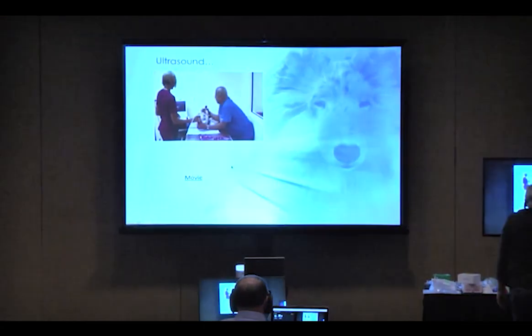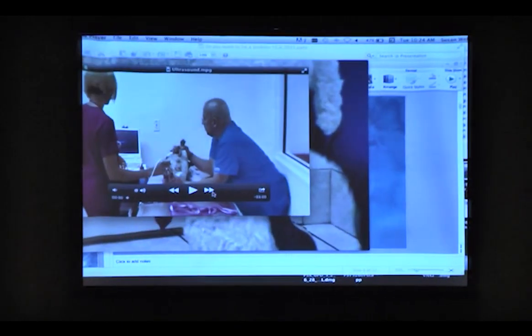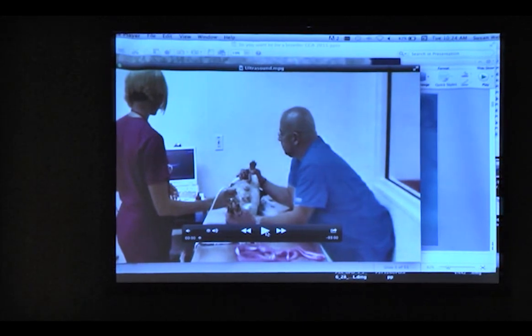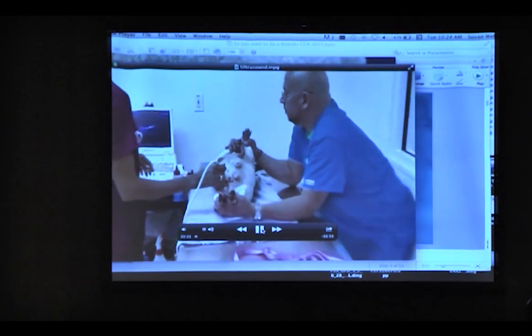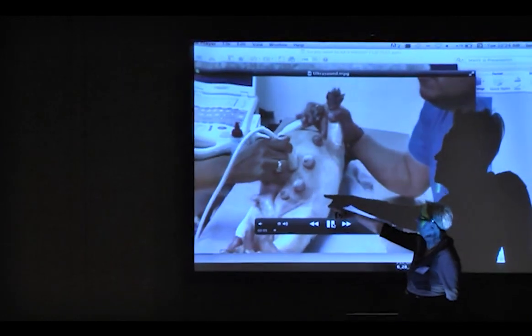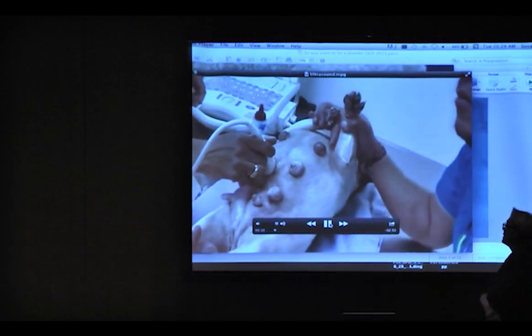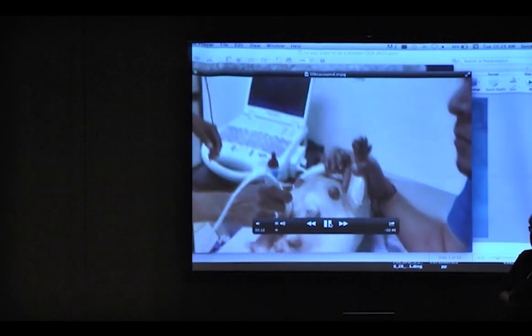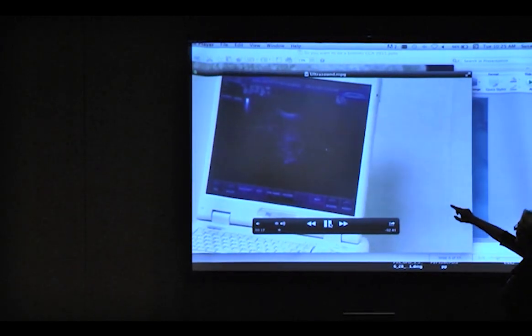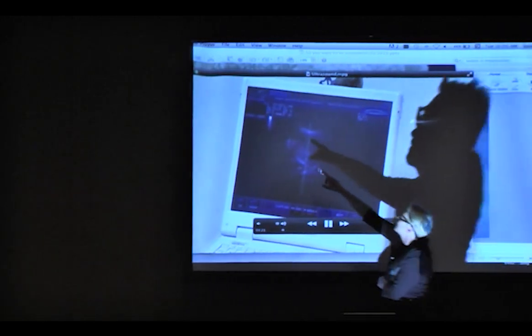All righty, here is a little ultrasound of a movie. This is obviously a bitch that has been bred many, many times, as you can tell by the giant nipples. But it's a Frenchie bulldog, you know? And if you can hear the sound on here, you will see a heart in there. Can you see it? It's right there.